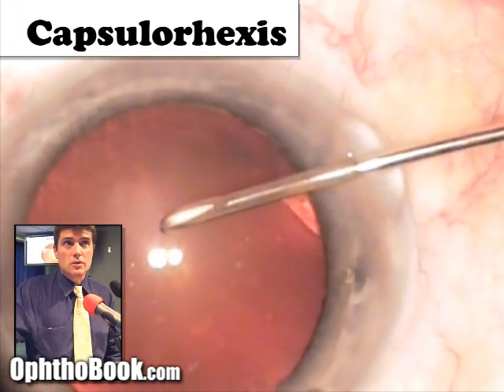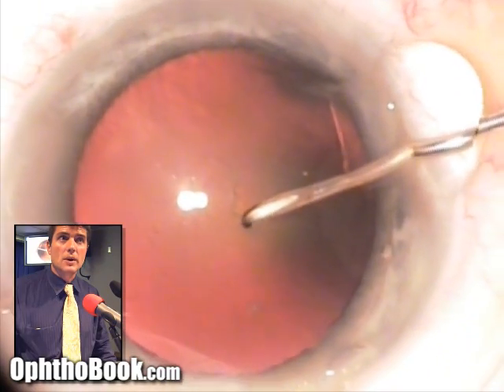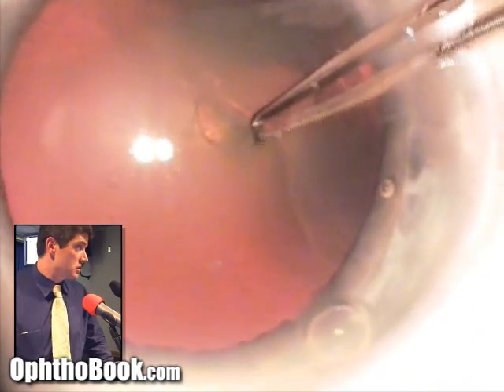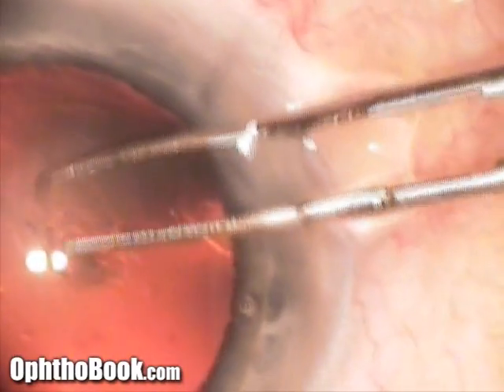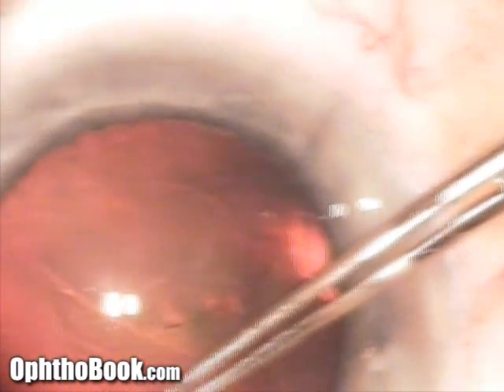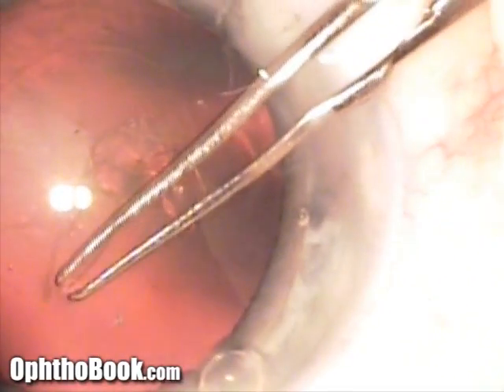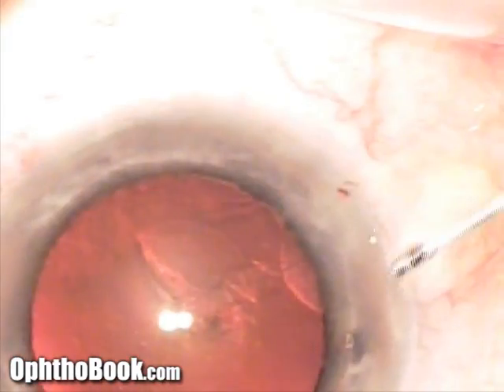Here is our cystotome — it's like a little needle — and we use it to make the initial rip in the front of the capsule for the capsulorexis. I make it a little sideways and pull it back to get things started, then switch to the utrata forceps for the main work. The capsule is very thin — like cellophane or saran wrap — so I take my time. It wants to run toward the edges; if it runs to the back of the eye you lose your pocket and can't place the lens. This is the moment when everything tends to go wrong, because if this step fails, the rest of the surgery is very difficult.